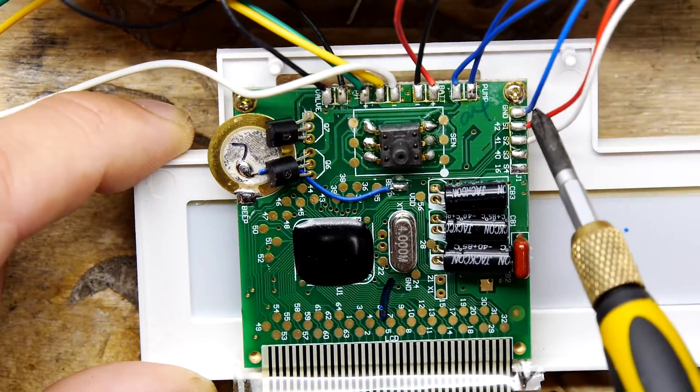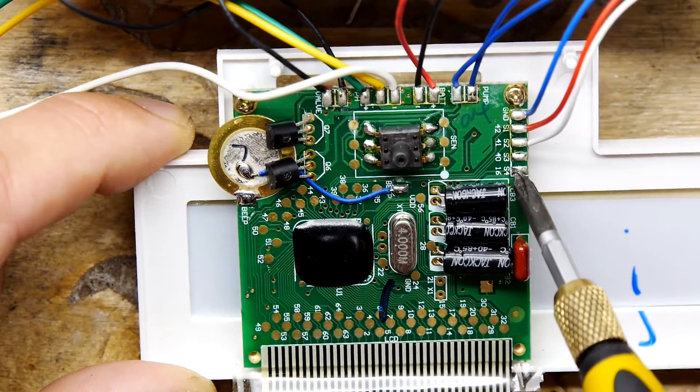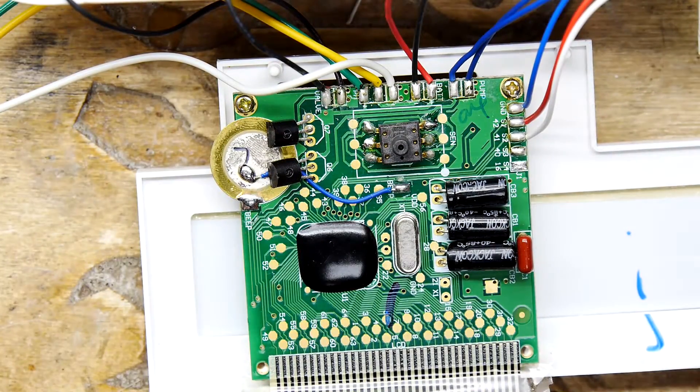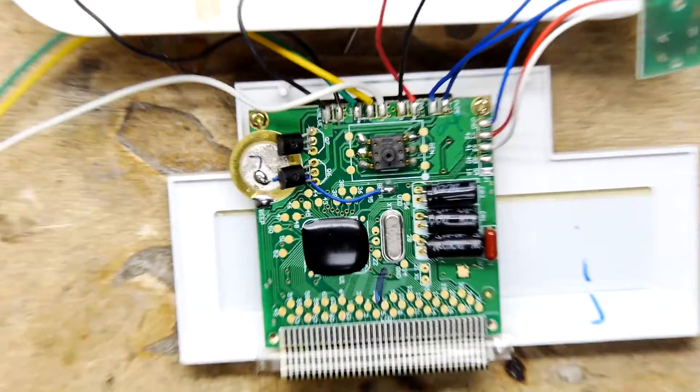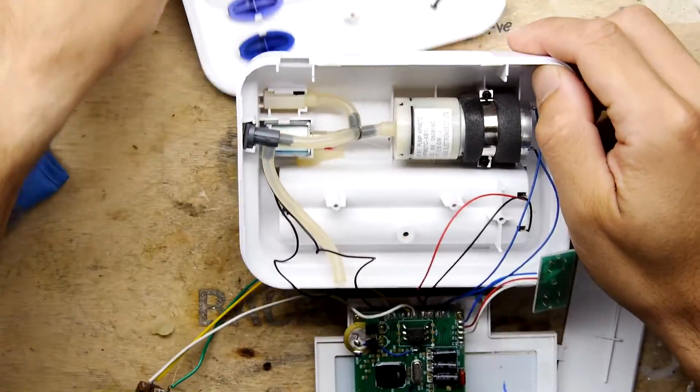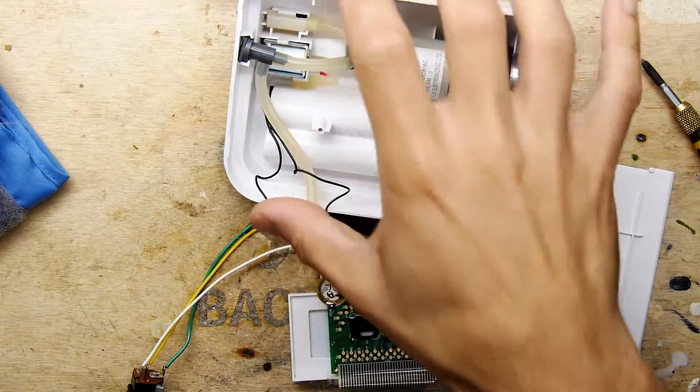And then you've got your three capacitors here. And of course, your inputs here, ground, switch one, switch two, switch three, and switch four. So really, there's no point just messing with this if we're not going to try to fix it, or at least diagnose what's going wrong with it.